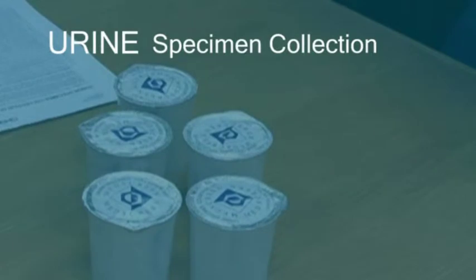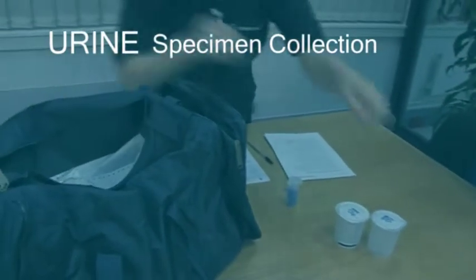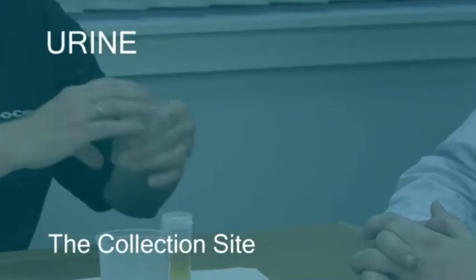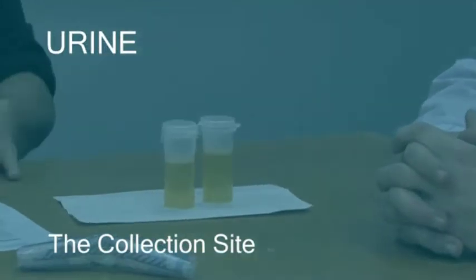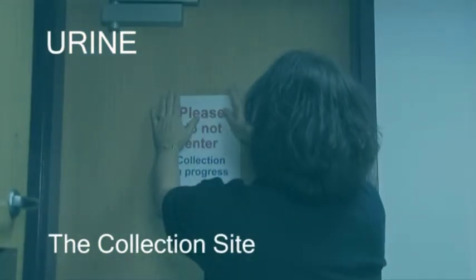Your equipment and collection kits must not be accessible to the donor or unauthorized personnel. Think about the layout of the collection site you are allocated, and position yourself and your equipment so that you achieve these objectives. Use Do Not Enter signs for the rooms you are using.